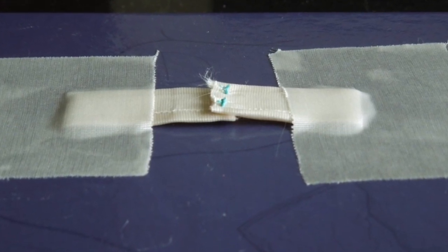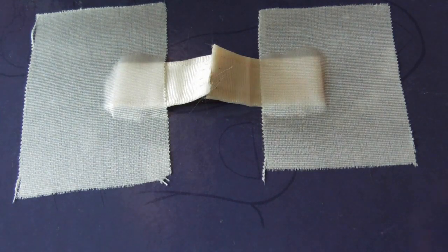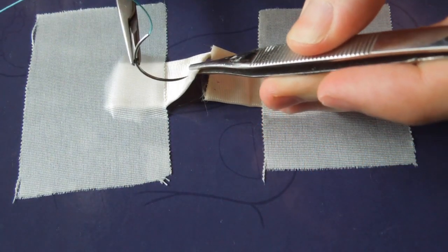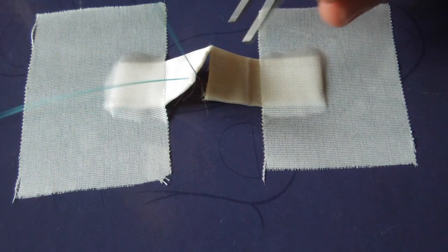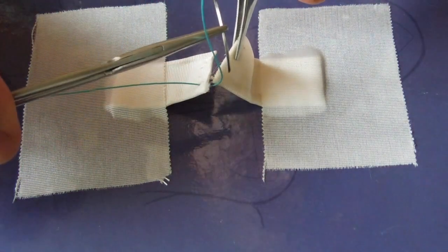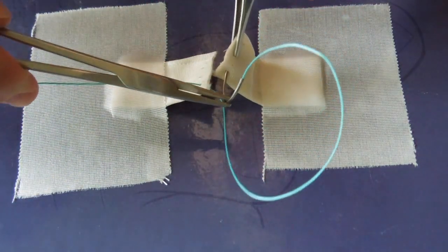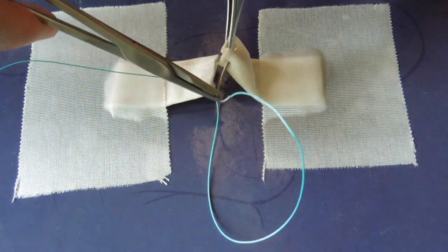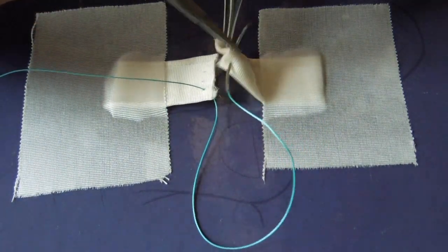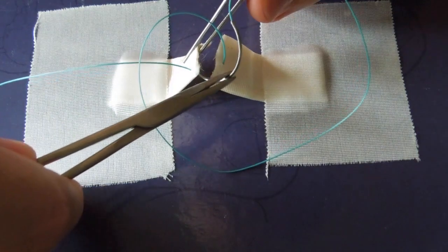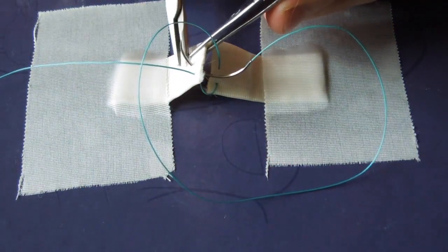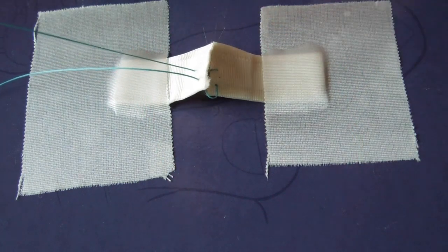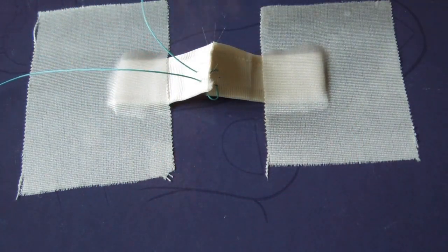Now this was done with four individual throws. This could also be done with three throws. So if we again start on the left, superficial to deep, but now on the next side, instead of throwing two individual throws, we simply throw one throw through that side. We can remove one step of this process, and again we have the same result here.